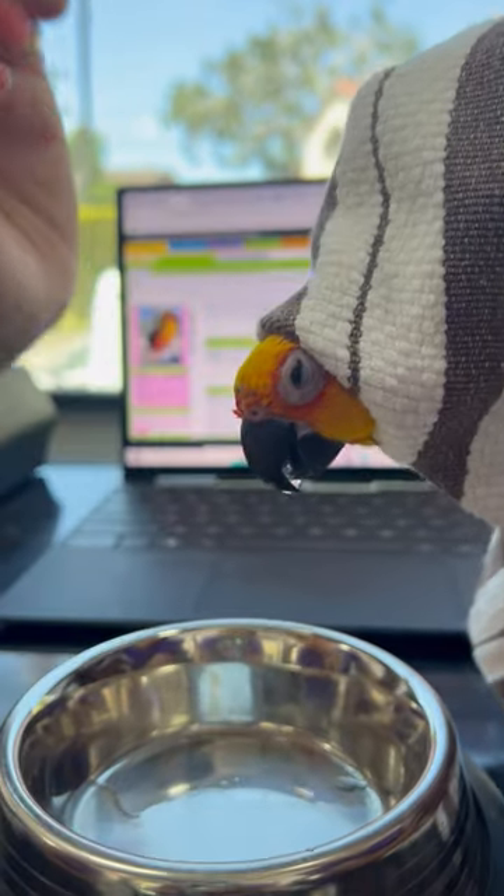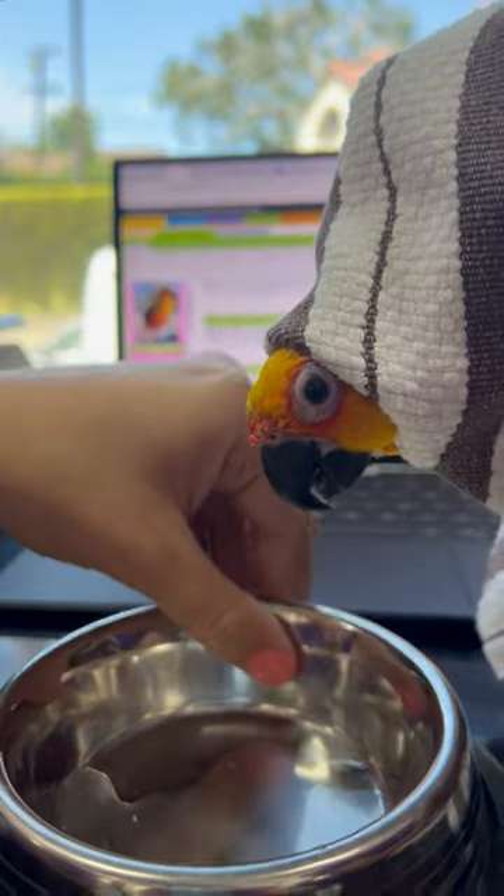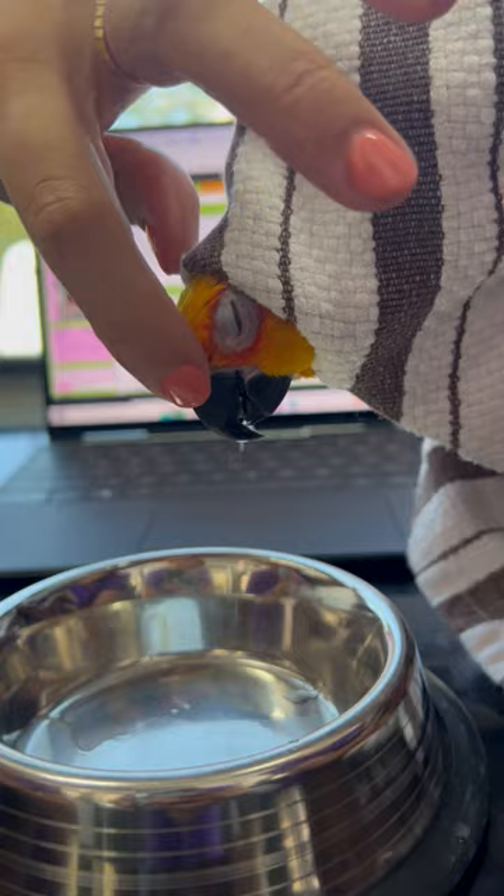Got a good booger out. She's just going to cough it a little bit — that's a good booger. And then let's do it on the other side.